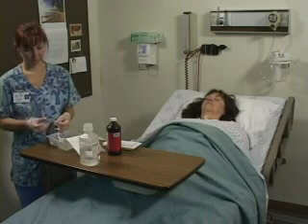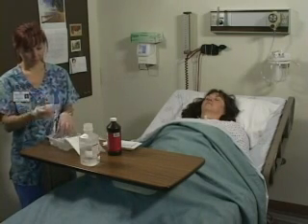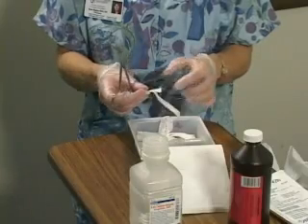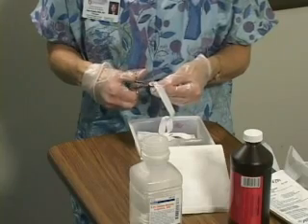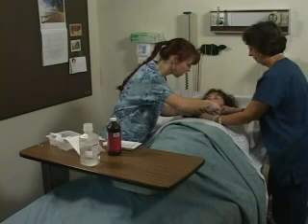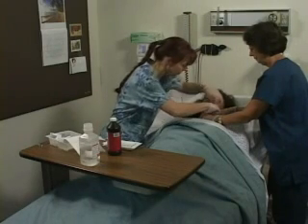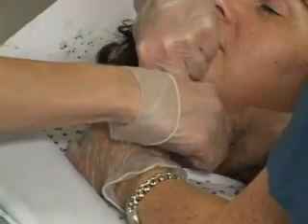Cut 2 pieces of twill from the tracheostomy cleaning kit, about 12 to 14 inches long. Make a fold about 1 inch below the end of each piece of the tape and cut a 1/2 inch slit lengthwise in the center of the fold. Have the second person gently hold the tracheostomy tube in place with gloved fingers on both sides of the neck plate and providing reassurance and distraction to the client.